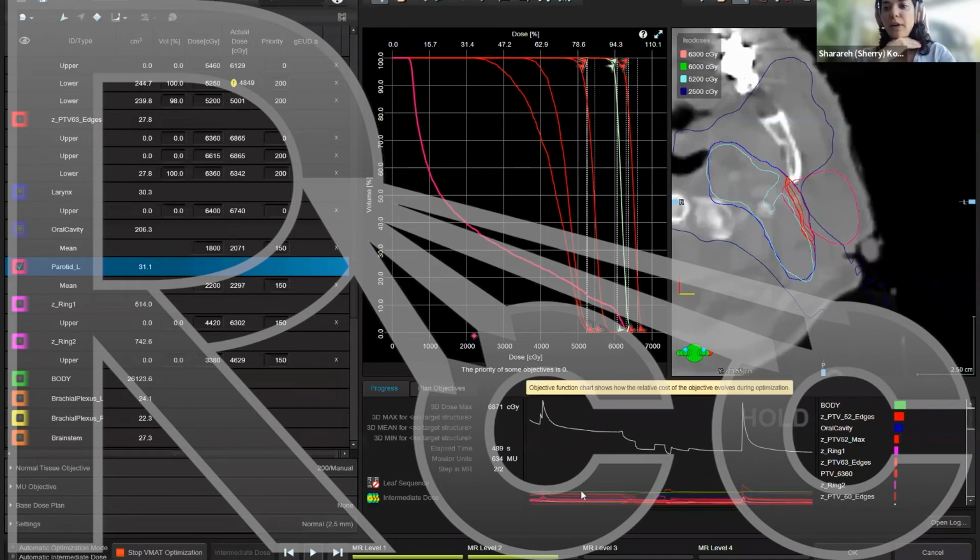Awesome. Great point. And Jonathan asked a question. I'm not sure if he private messaged me, but I think it's a great question, so I'm going to read it to everyone. Does tissue density have any contribution to the performance of the optimization? I'm going to just copy and paste it in the chat so everyone can read it.